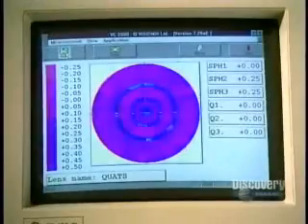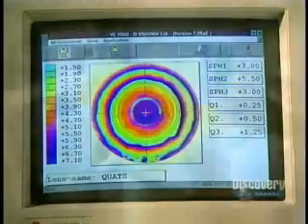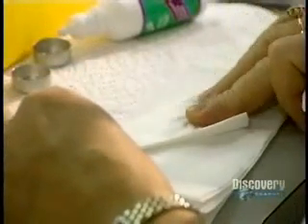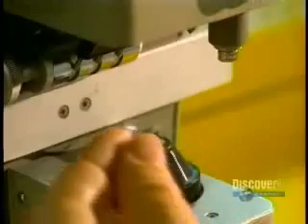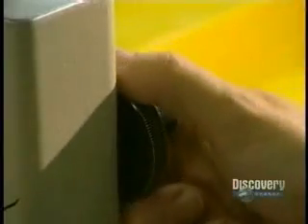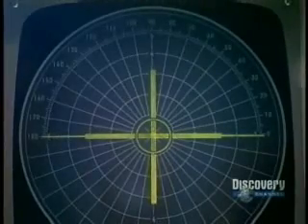This optical topographer is used to verify through color distribution whether the spread of optical power in the lens is precise enough to assure perfect vision. And now we proceed with another important testing procedure. The soft, fragile lenses are always handled with the greatest of care. This unit, called a frontofocometer, is a metering device which verifies the optical precision of the lens.